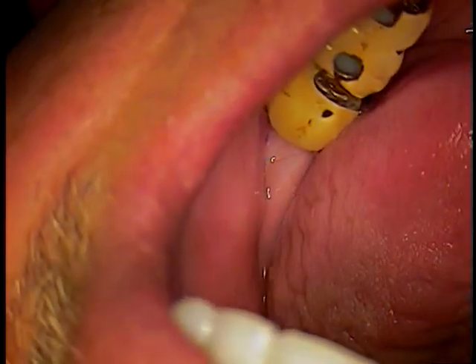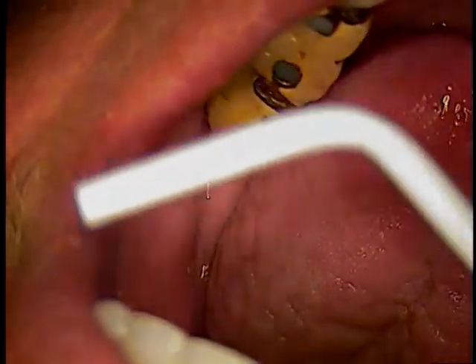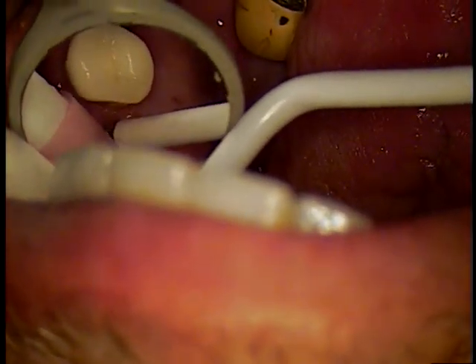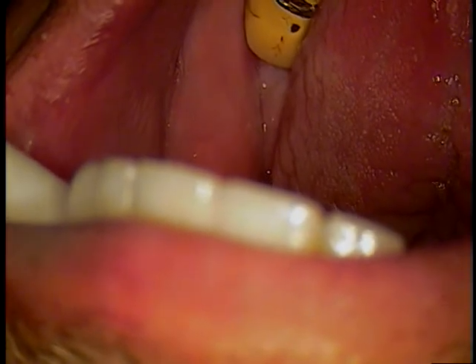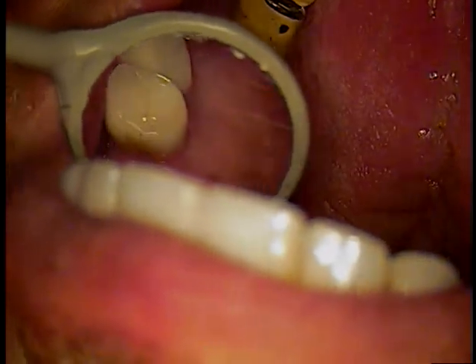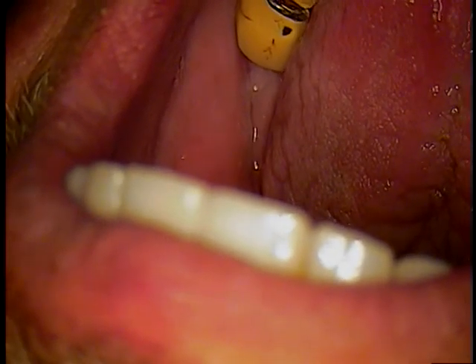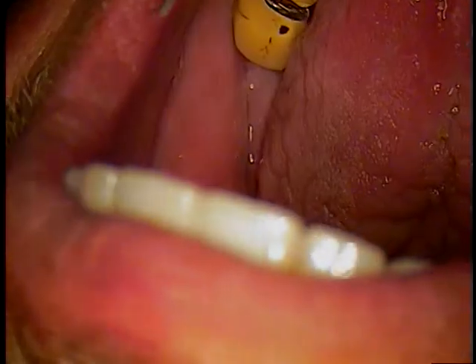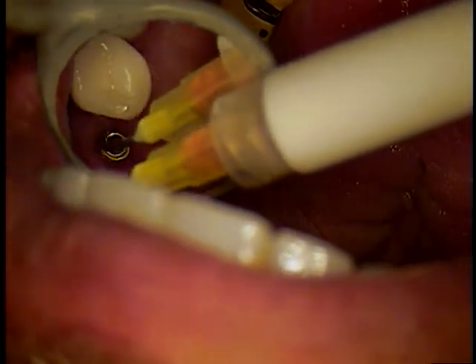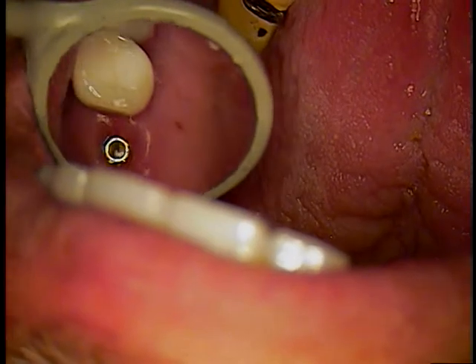Okay. I'm going to rinse this out. Turn away a little bit. Okay. There's calculus on there. Just want to get some of that off. Okay. Microsuction. Okay. Well, we got the one. And by golly, he's in good shape.